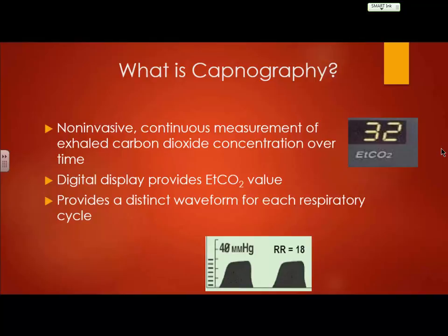All right? But with CO2 monitoring, it's going to tell you in real time what's happening as far as when you expire out. With your oxygenation, with your SpO2 monitoring, it may take a couple of minutes for you to really start seeing the values change. Why is that? It's in the periphery versus the central. Okay, all right. So yes, y'all are on to something there. It's in the periphery. It's looking at the capillaries. It's looking at the saturation of oxygen. What did you say?